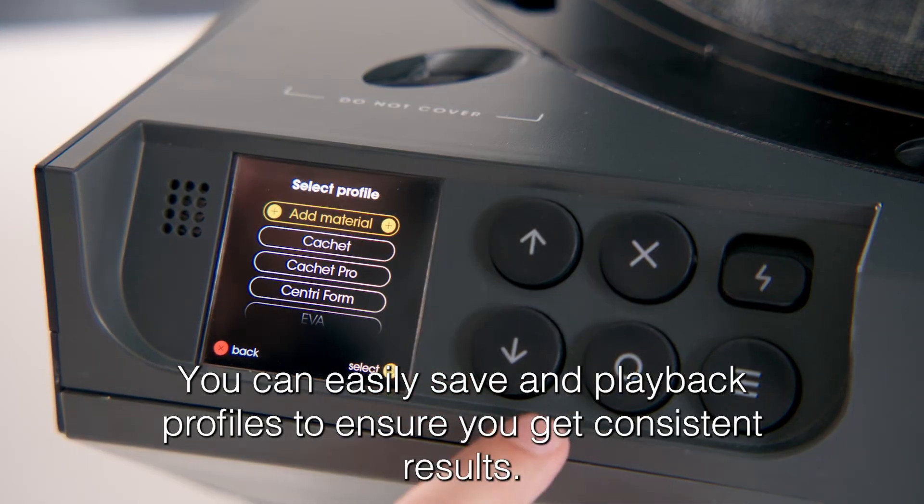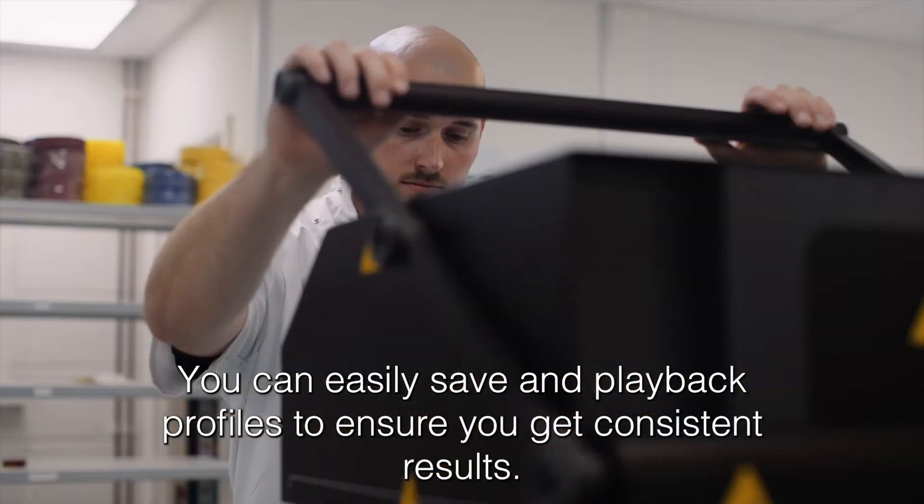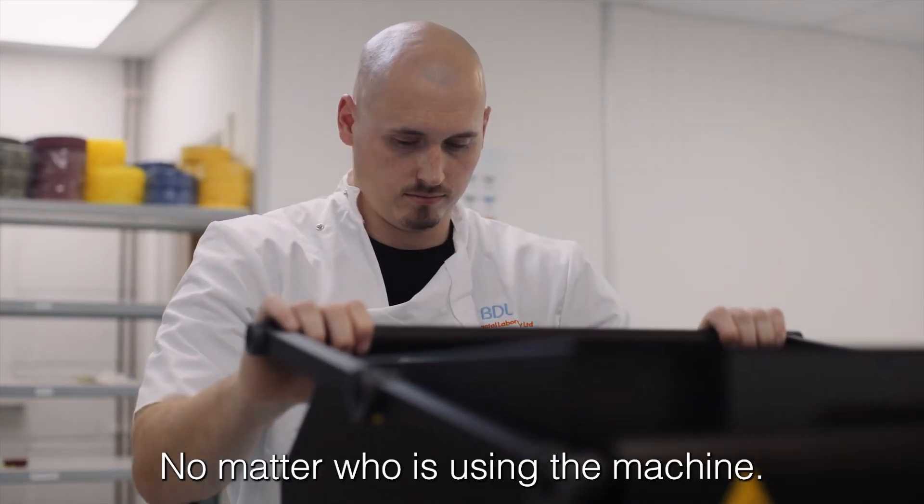You can easily save and play back profiles to ensure you get consistent results no matter who is using the machine.